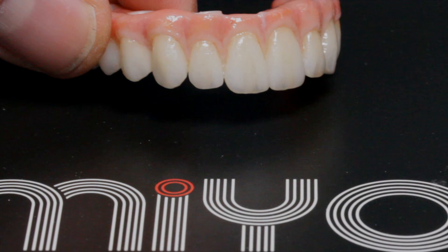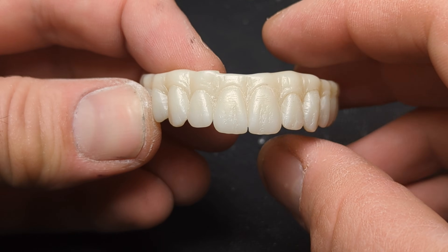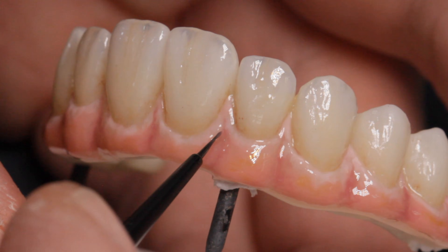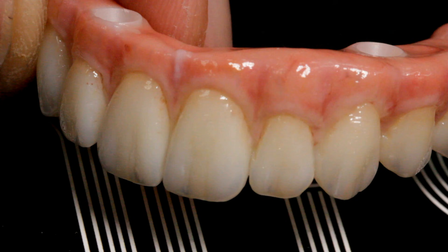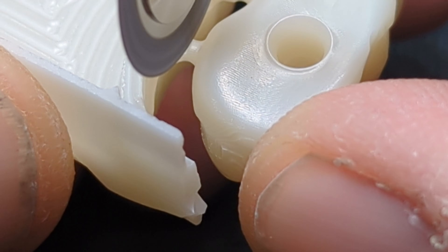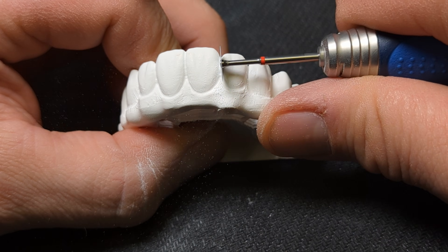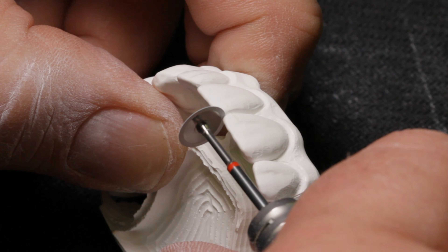This is the full process of how to finish an all-on-four monolithic zirconia implant bridge. I will show everything from layering pink and creating a natural-looking gingival to create lifelike-looking teeth. I will guide you through a special zirconia green state process, a technique that will elevate your work and create aesthetic-looking teeth that will set you apart from the rest.